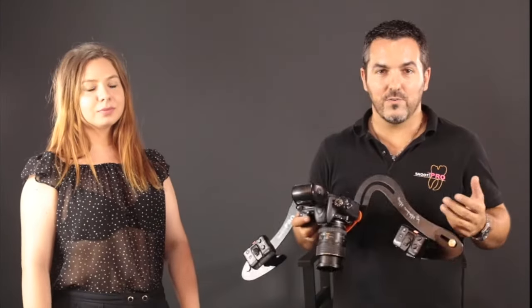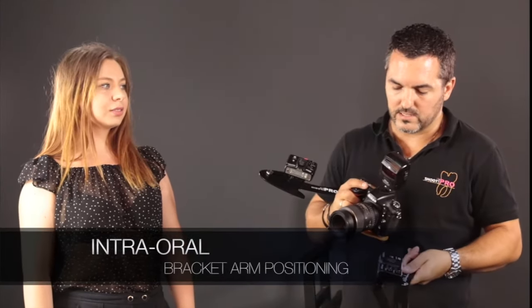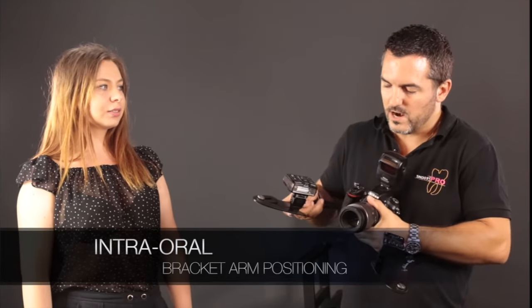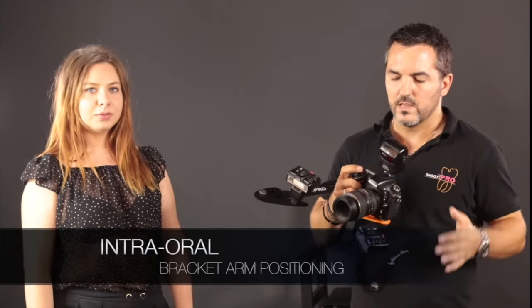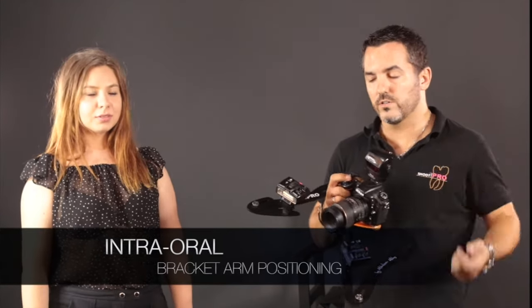And finally, if you want to go for intraoral photos, all you have to do is just get a little closer with the arms and orient the flashes towards the mouth. In this way you will have good illumination in the buccal corridors.